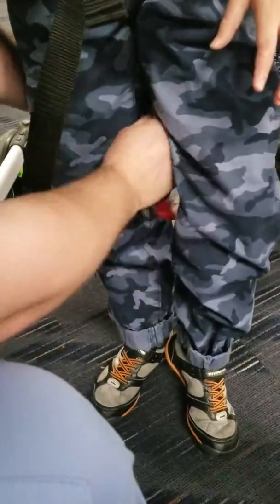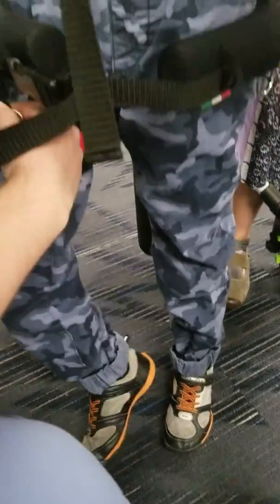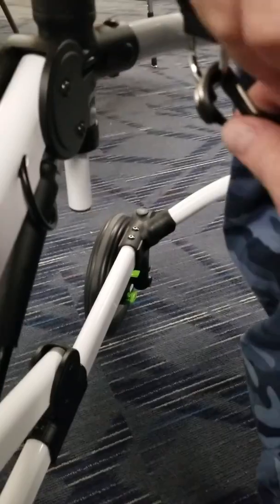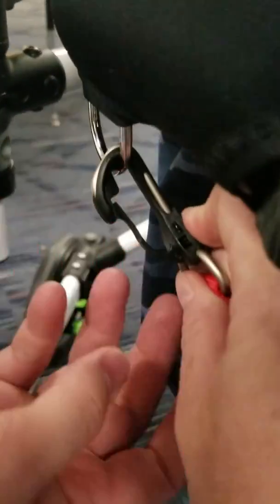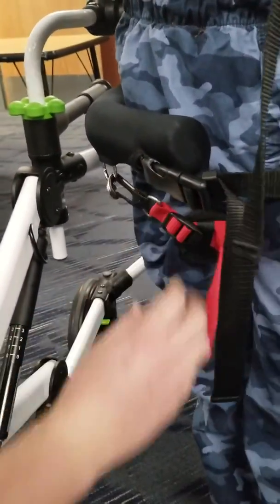These are the straps. Originally I think we'd had them backwards, so they were like that, and they were digging in. So now what we've done is we face them outwards like this. So we face outward, and the clip is there. And it seems to be a better angle, because how it was, it was kind of digging in.